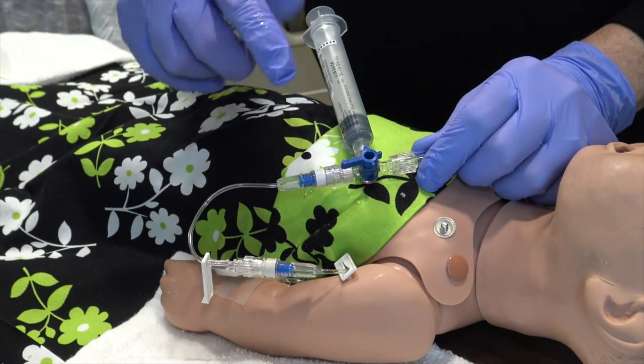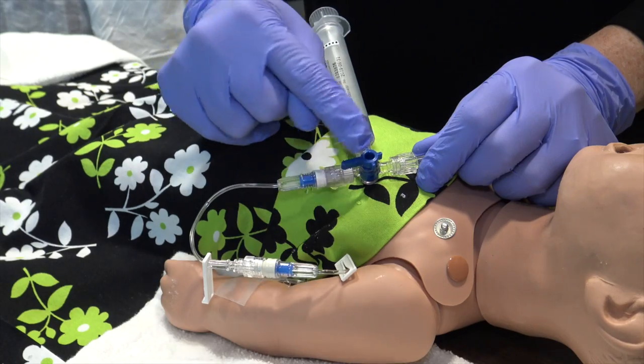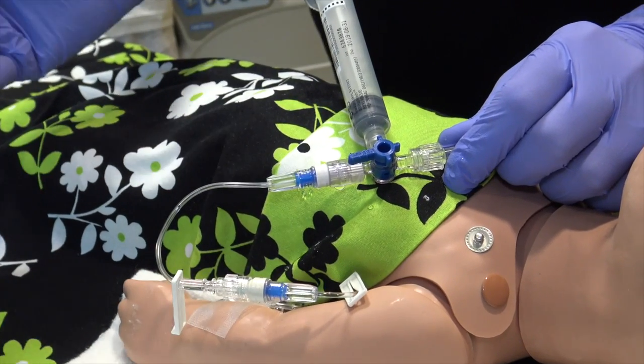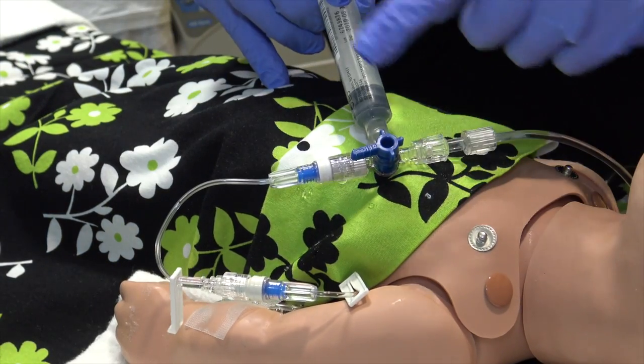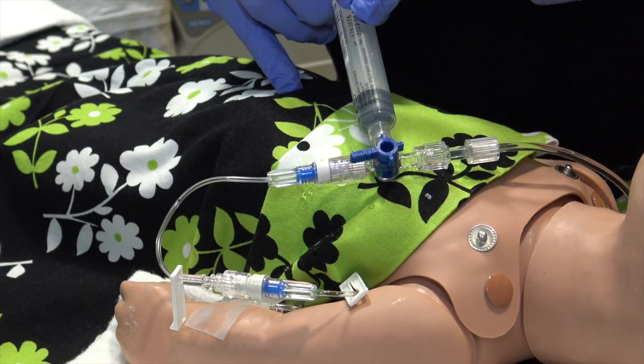Now remember, when working with the stop cock, whichever end this long tail of the stop cock is pointed towards, that's the end that's closed off. The way it's positioned now, the IV fluid line is open to the syringe.